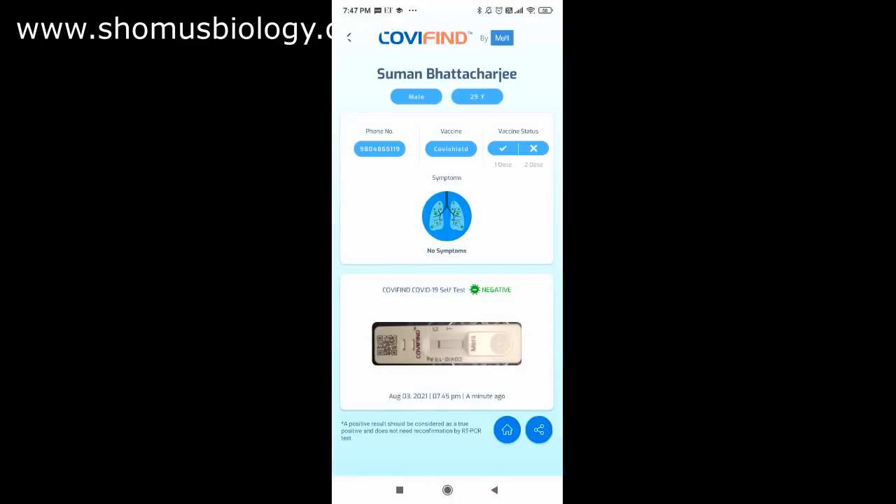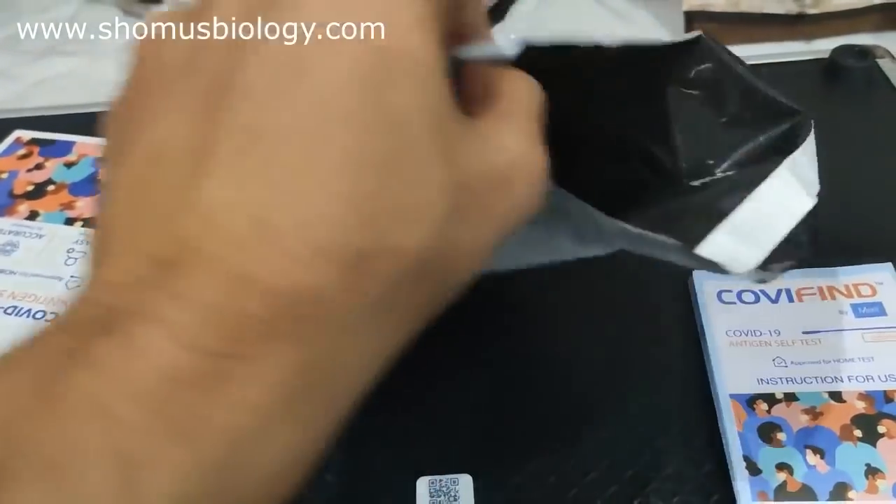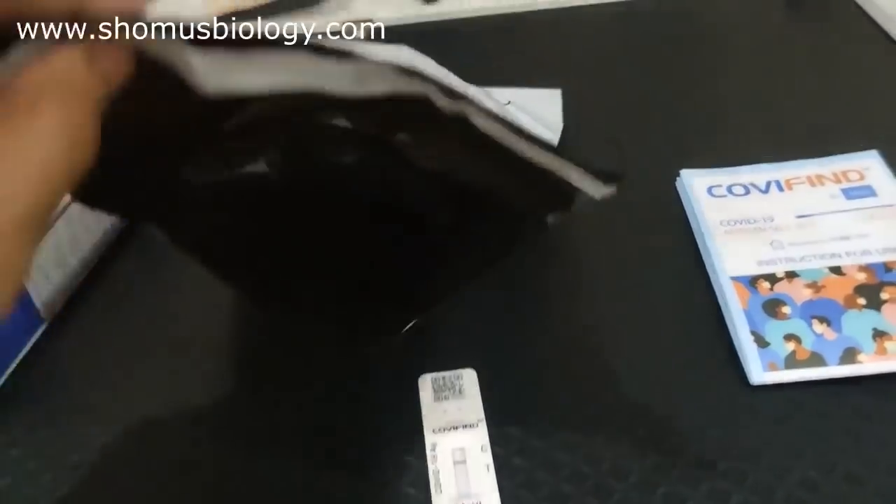One thing this kit lacks compared to Coviself is that it doesn't generate a PDF report — Coviself does, which is handy for printing and showing to authorities. With this kit, you can take a printout of the app screen or show the report image on your mobile phone. The report history is accessible within the app, so you can always retrieve and show previous results.